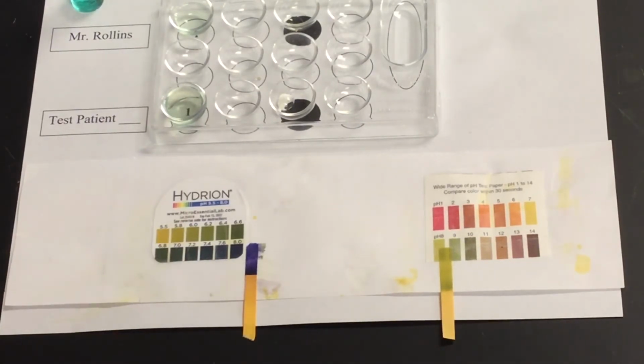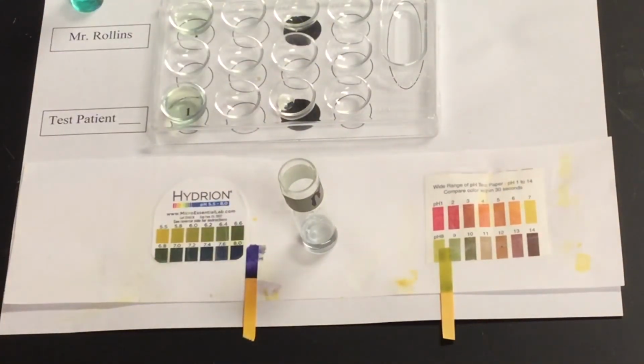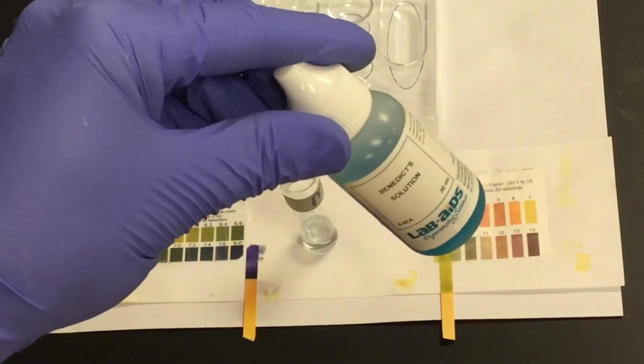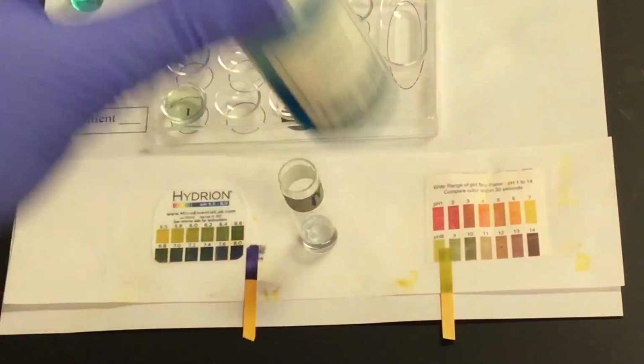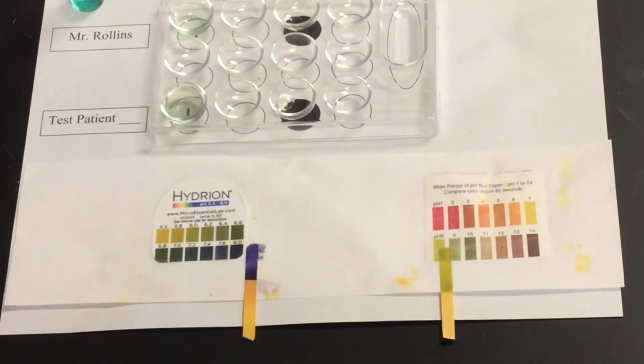From there, we want to take our sample, our glass tube, and add our Benedict's solution to it. If you remember, Benedict's solution is the one that tests for glucose. To our glass tube of 10 drops of urine, we are going to add 5 drops of Benedict's solution, and put that in the hot water bath. So that goes off for us.